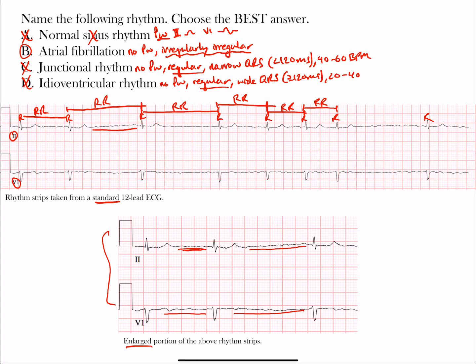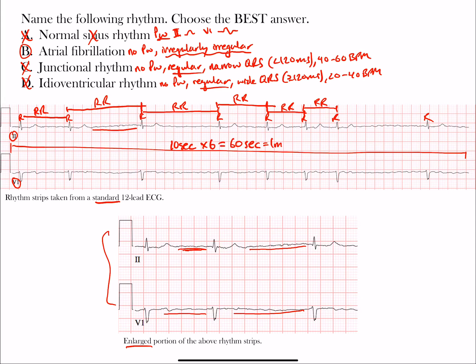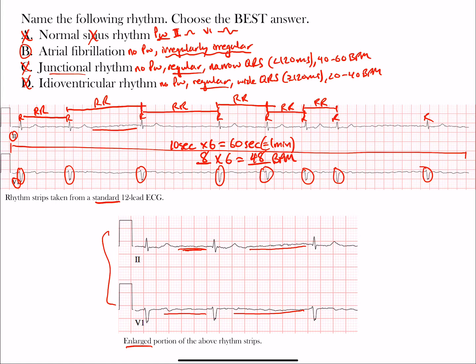Idioventricular rhythm has a normal rate between 20 and 40 beats per minute. Now let's calculate the rate here. The standard ECG from beginning to end is 10 seconds, and 10 seconds times 6 equals 60 seconds — one minute. So we count the QRS complexes across the strip and multiply by 6. Counting: 1, 2, 3, 4, 5, 6, 7, 8 — that's 8 QRS complexes. 8 times 6 equals 48 beats per minute, which is a slow rate, less than 60.